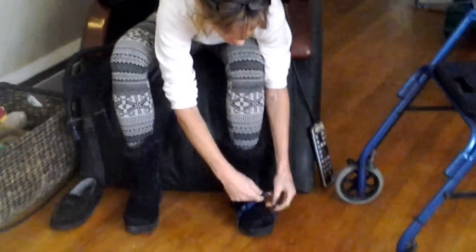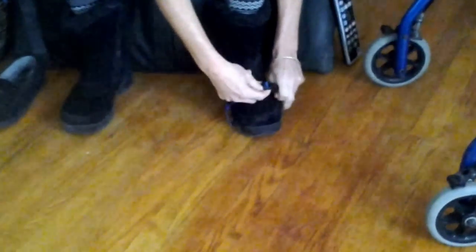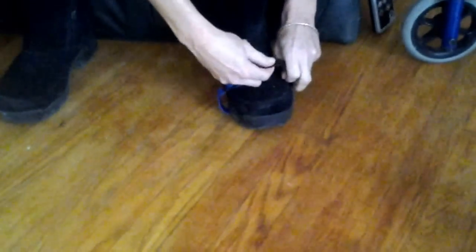And then what you're going to do is hook it up here, around your boot or your slipper. You can do that around your slipper too. Now with that, I want to show you how this works.